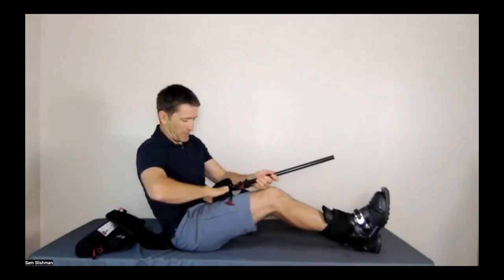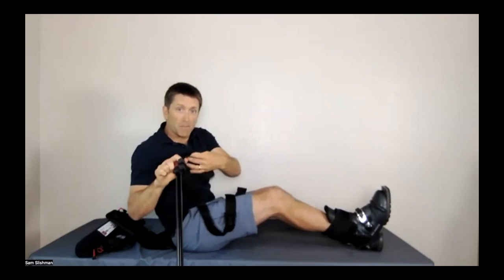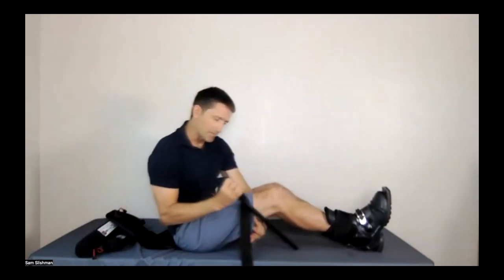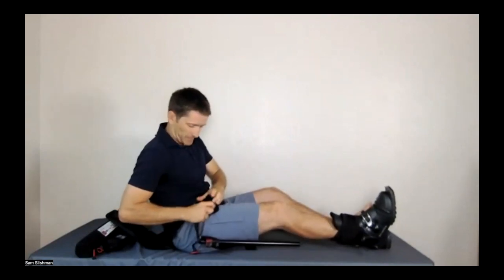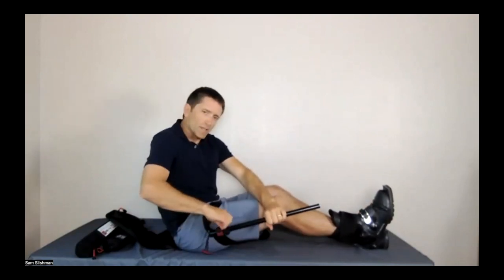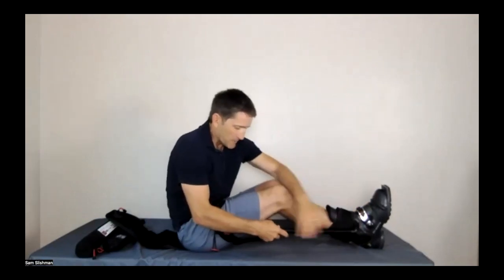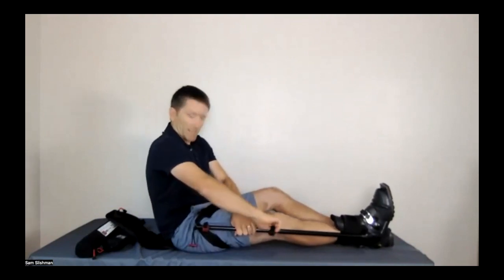My next step is I'm going to put the female buckle anterior to my thigh. The male end is going behind my thigh. And this does not have to be very tight. I loosen, I call this the course adjustment. So I loosen that, get this into place, extend it, and now lock.